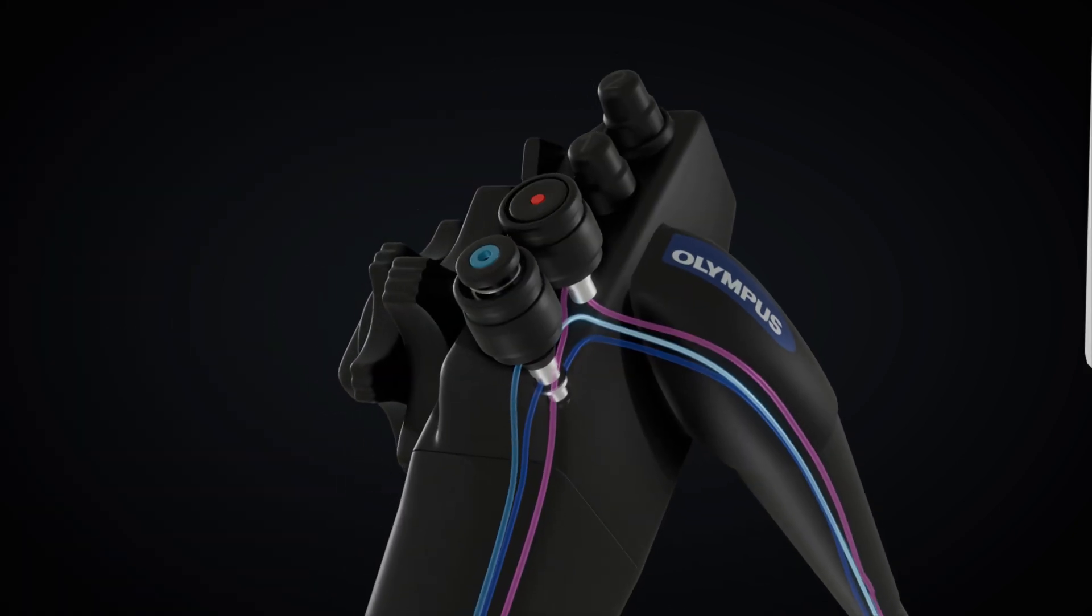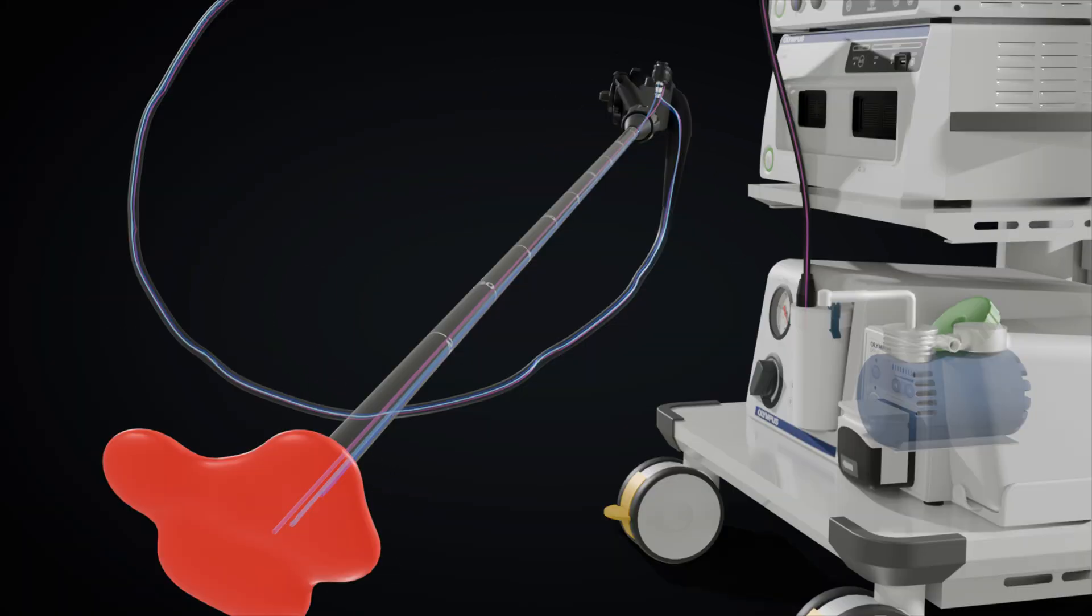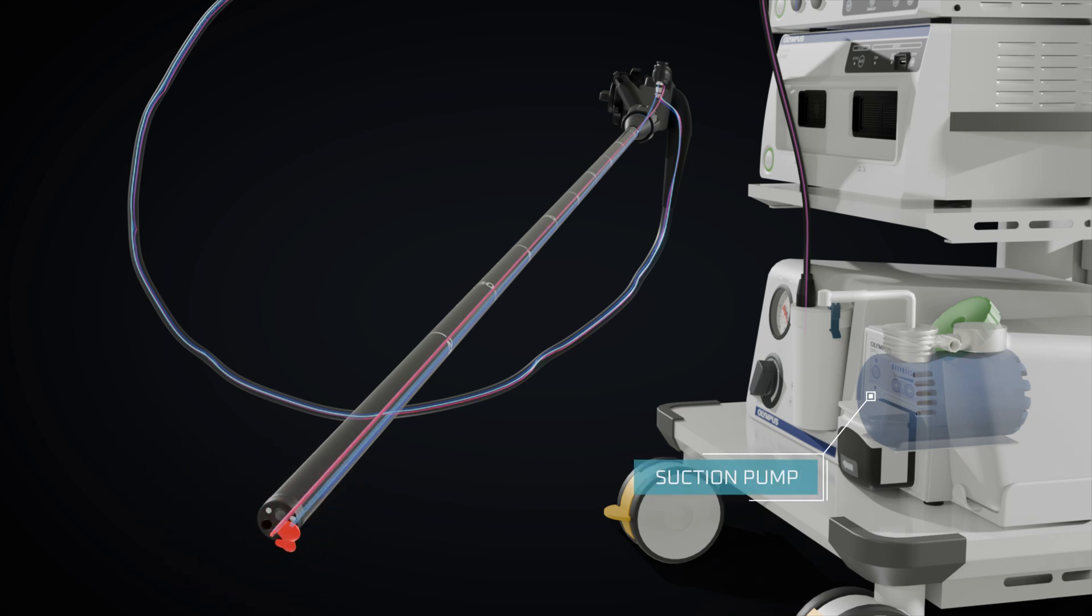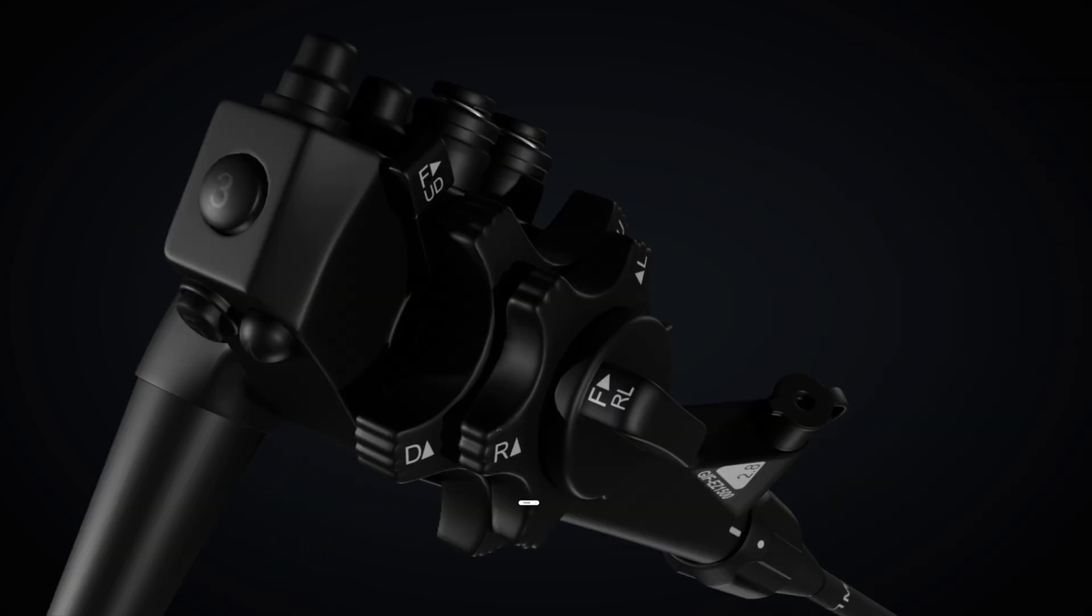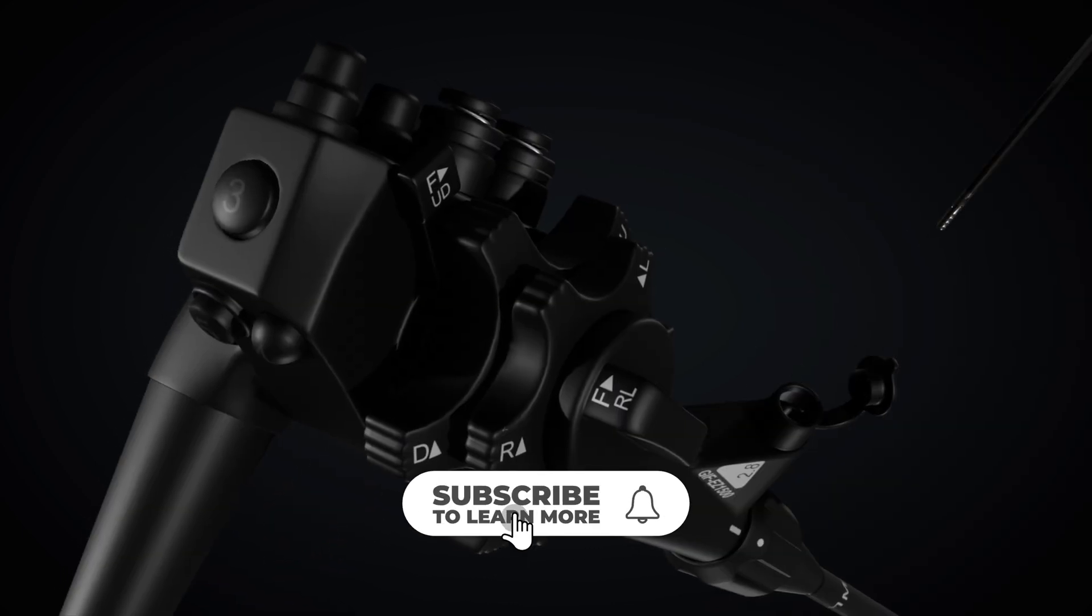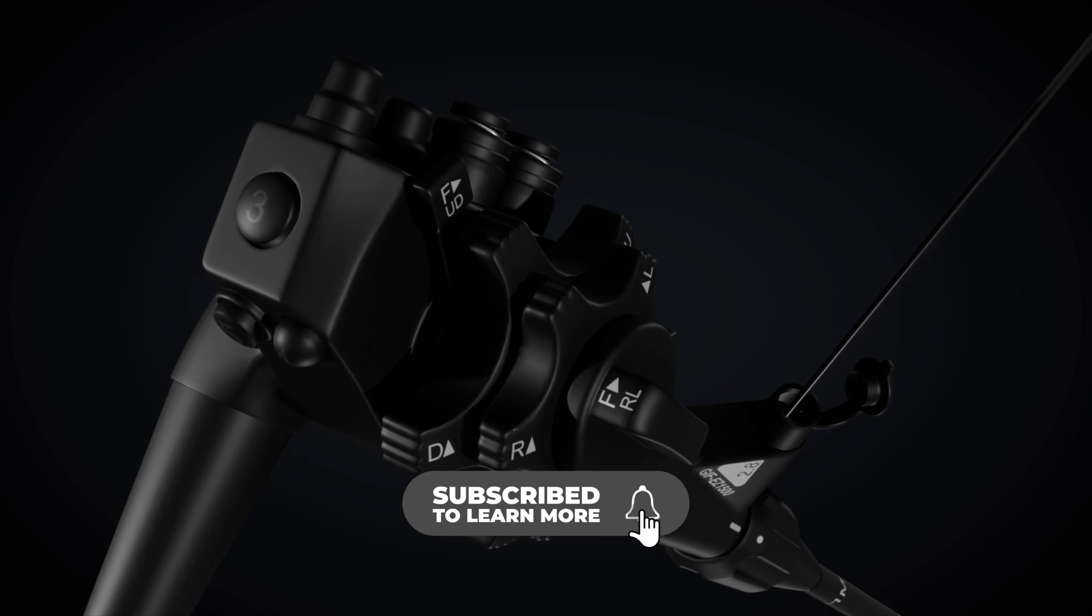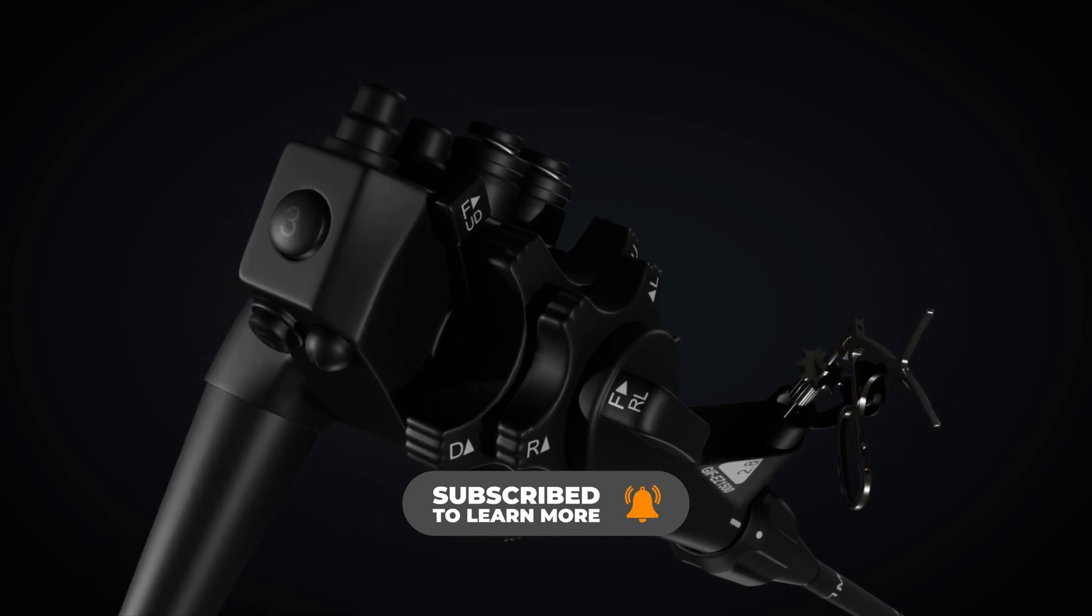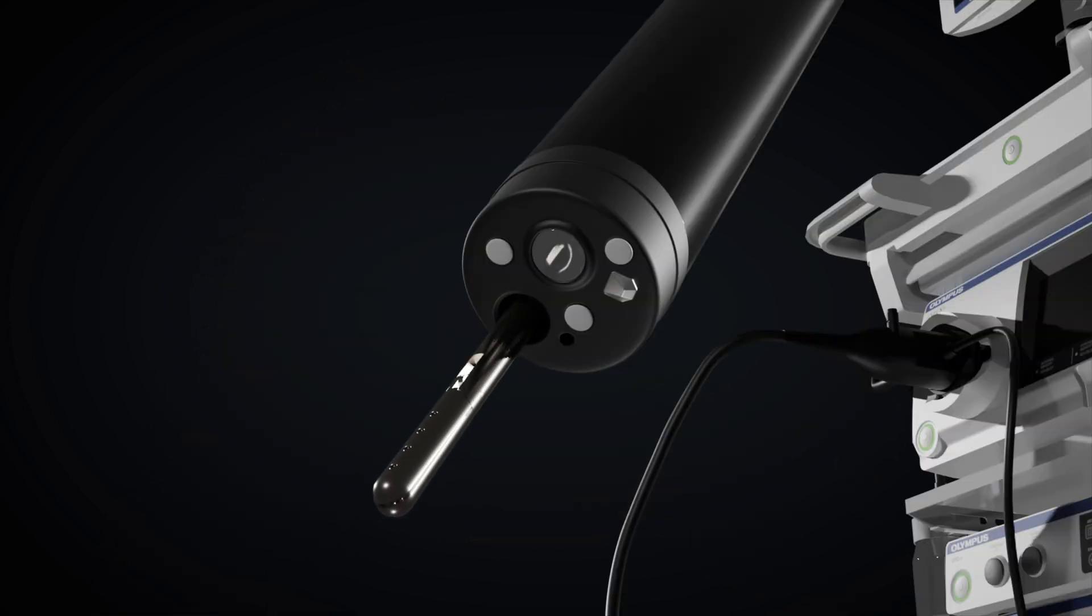Depressing the suction valve enables the removal of fluid obstructions for clearer tissue observation. The instrument channel accommodates endotherapy devices for procedures such as biopsy and other treatments.